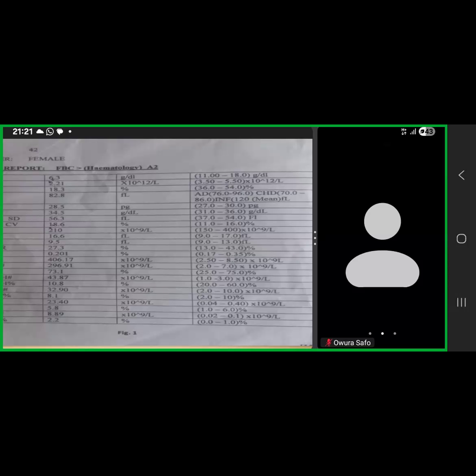We are still doing workups in hematology. Don't forget what workups are about. We have looked at two different scenarios. This is the third scenario where we have presented actual results. After commenting on results, you give us a presumptive or provisional diagnosis.